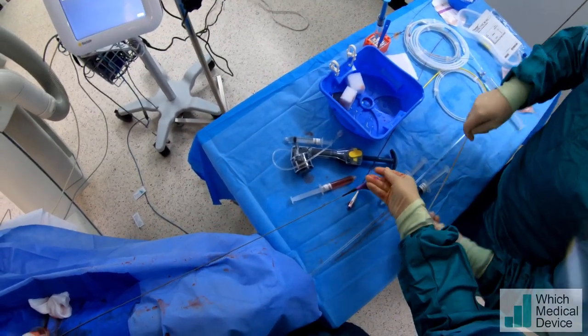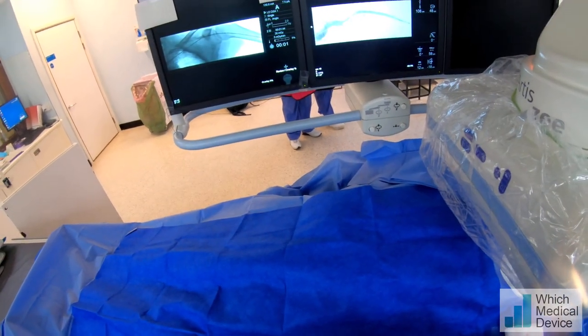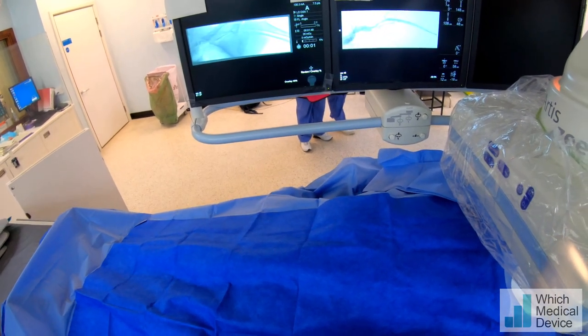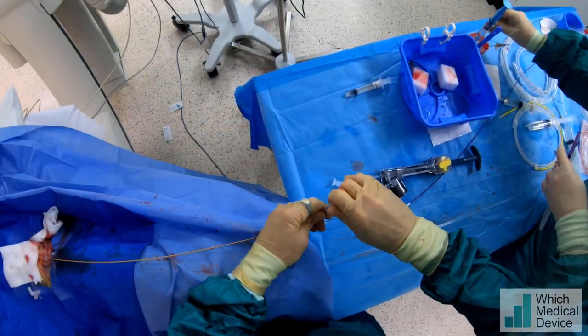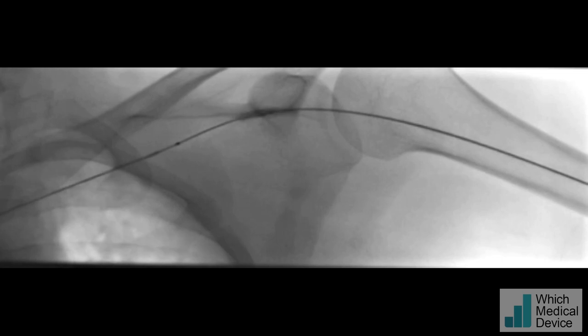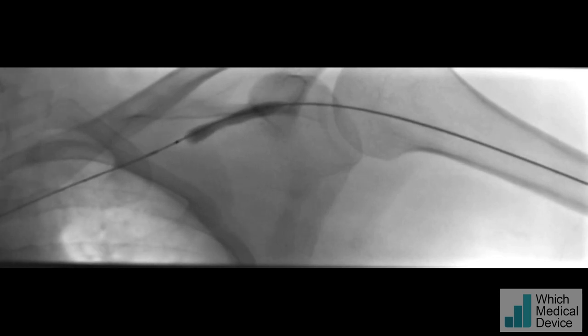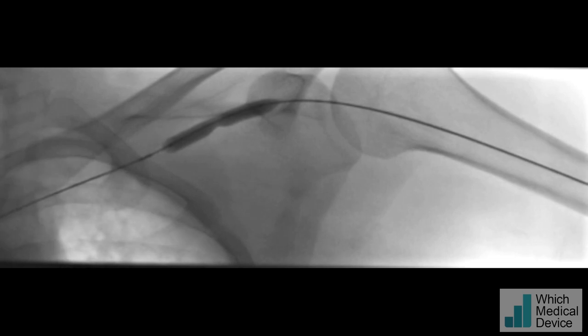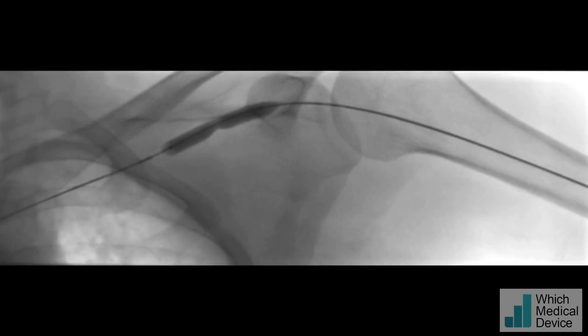So we're going to take out the standard balloon and go for a higher pressure seven millimeter balloon. We're just going to take this balloon around that stenosis again — we want to be about there. So this will be tight again. You can see there's still significant waisting there, which is no great surprise. Going to leave that a moment or two — how does that feel? Can you bear a bit more? Yeah, okay.